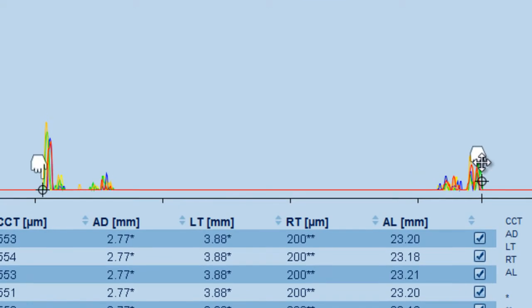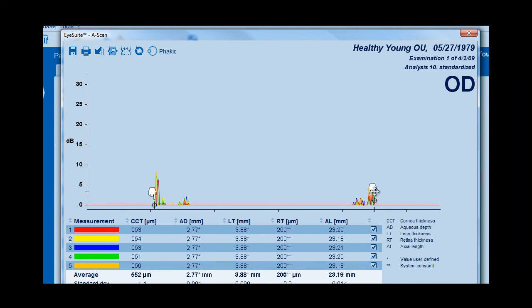The anterior lens gate should be located at the beginning of the first lens spike. The posterior lens gate should be located at the end of the last lens spike. Gates should not be adjusted along the same spike color, as this could result in a false measurement.